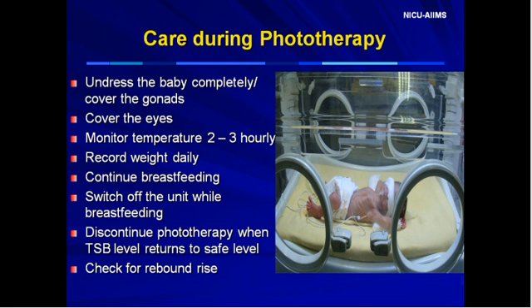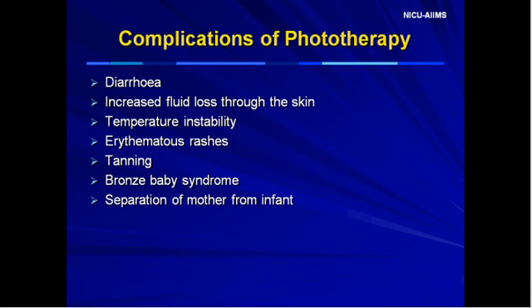Discontinue phototherapy when the total serum bilirubin level returns to a safe level. Check for rebound rise within 24 hours after stopping phototherapy. Remember that eyes should be covered to prevent retinal damage by bright lights. Another important point to be emphasized is that adequate hydration and stooling has to be ensured while the infant is under phototherapy. Every intervention carries the risk of side effects, hence it is very important to timely detect and manage them.